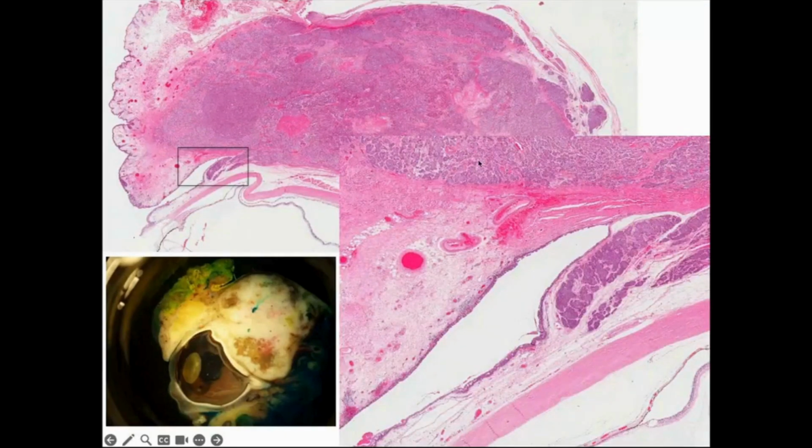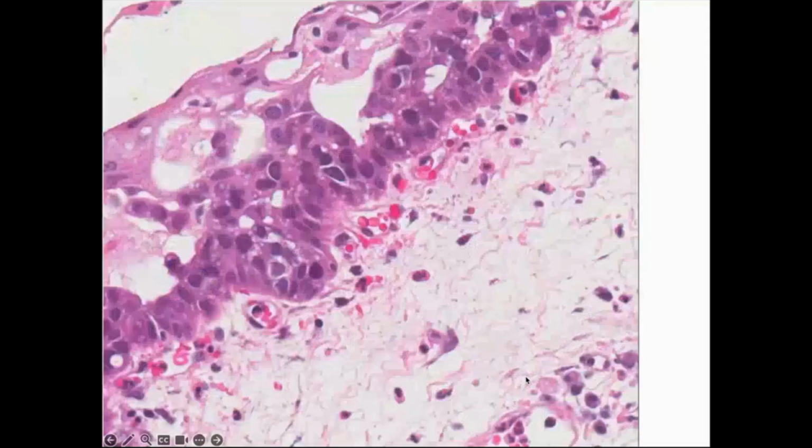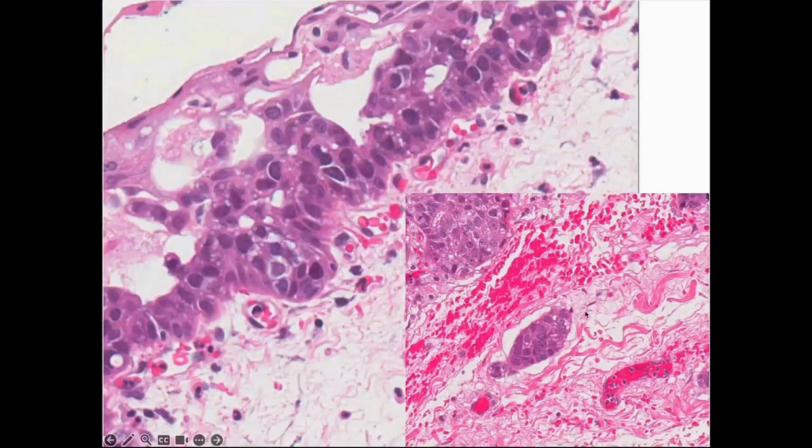And you can see not only the sebaceous carcinoma cells within the orbit, but also at the limbus, being the junction between the cornea and the conjunctiva. And you can see the spreading of the tumor cells within the epithelium, and also the involvement of lymph vessels. So this is a very aggressive sebaceous carcinoma, which led to orbital exenteration in this patient's case.